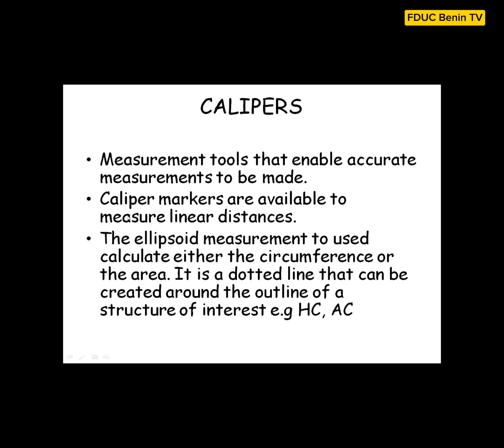You also have the ellipsoid function of the caliper, able to take measurements of circumferences, especially the head circumference and abdominal circumference.